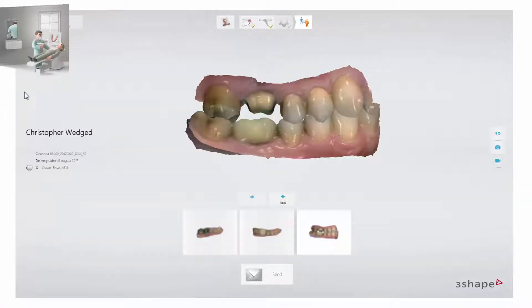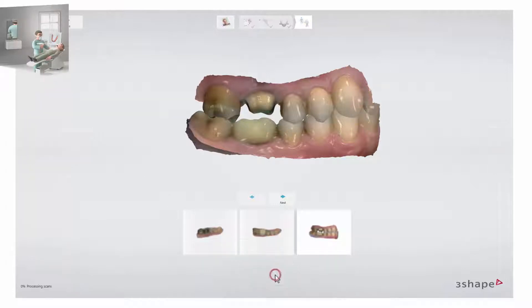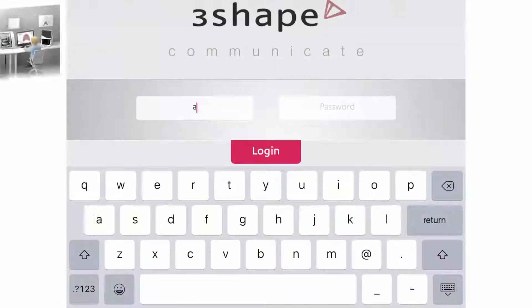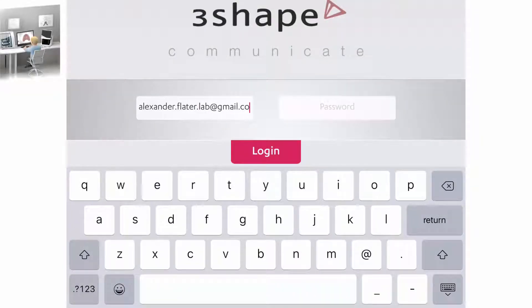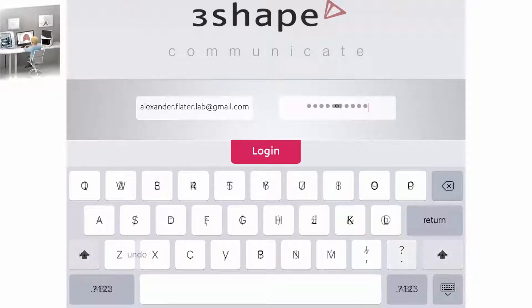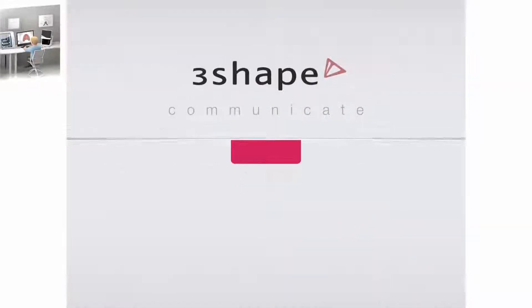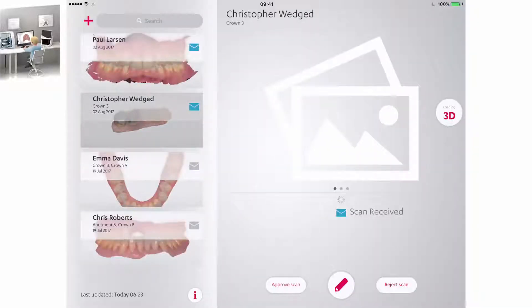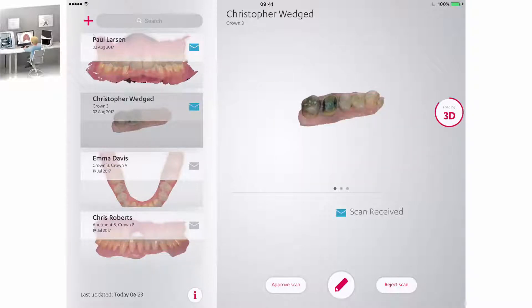First, a case must be sent to a chosen lab. Click the send button in the Trios software. That option is available on the communication page in the Trios workflow. To use the 3Shape Communicate mobile application you must sign in using your Communicate account login and password, then touch the login button. A sent case can be reviewed in 3Shape Communicate even if you don't own any 3Shape software. Select a case that requires your attention from the list on the left side of the screen.